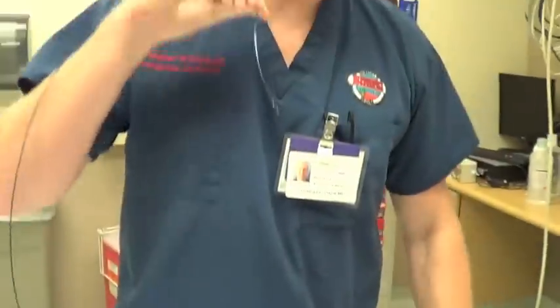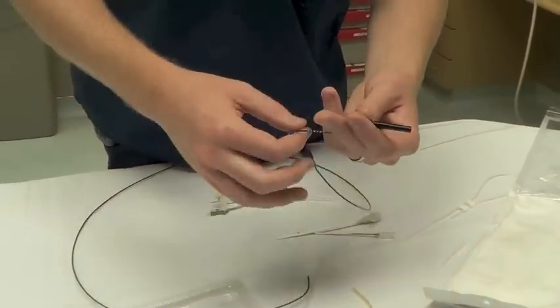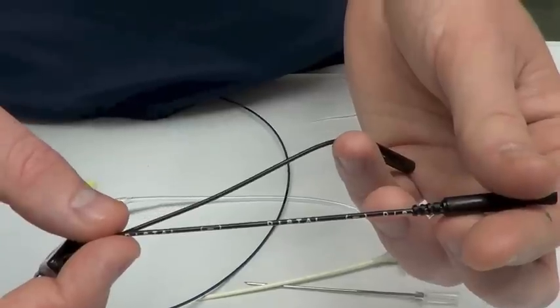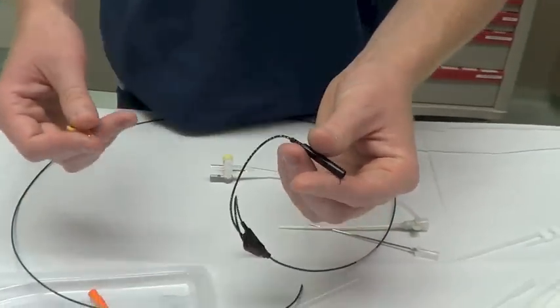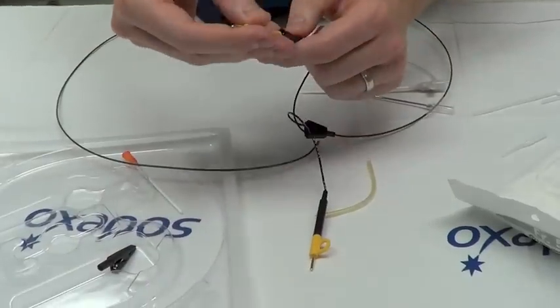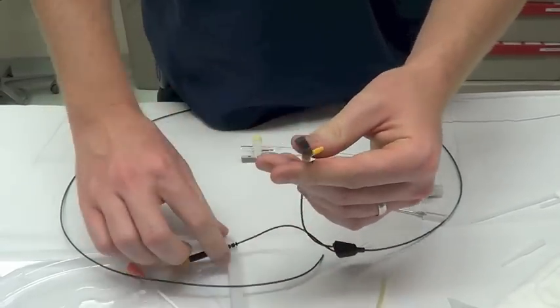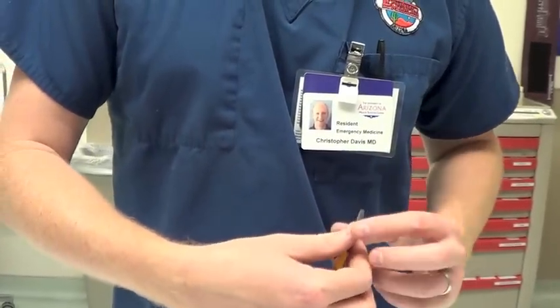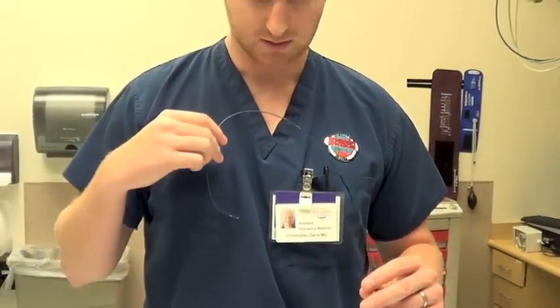Once your sheath is loaded and you're ready to insert your pacemaker wire, you first need to load these ports — this is where your helper comes in. The negative lead is labeled distal, and that's the lead you'll hook up to the V2 port on the EKG machine. Set up your EKG with all electrodes attached except V2. Place the yellow clips on, attach the black clip to the negative lead leaving the positive lead free floating, and your non-sterile helper clips this onto V2 of the EKG. As you advance the wire, you'll see the EKG changes you're looking for.